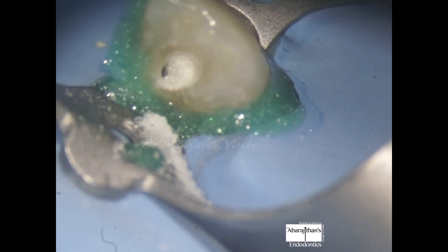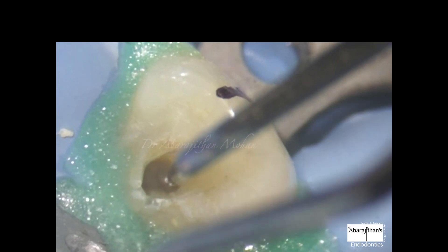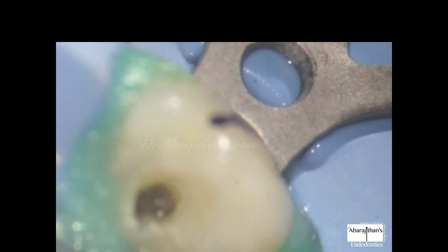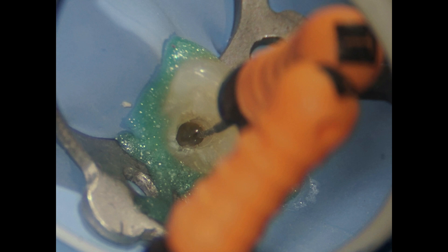Just after drilling one or two millimeters, check again with your DG16. The line drawn on the labial surface is very useful here. Once I get a purchase point, I use a hand K-file to negotiate the canal. My choice here are orange files — you can use C-Plus files, which are carbon steel files.